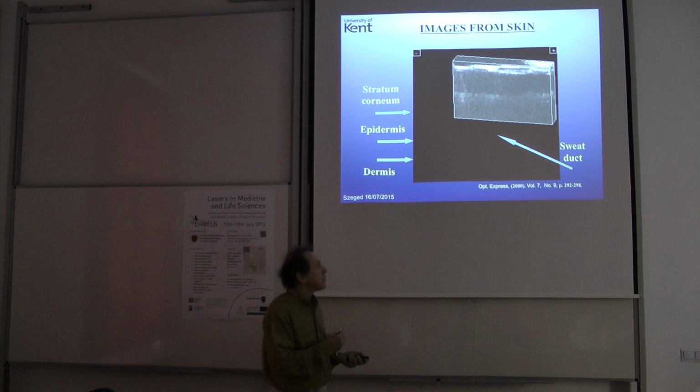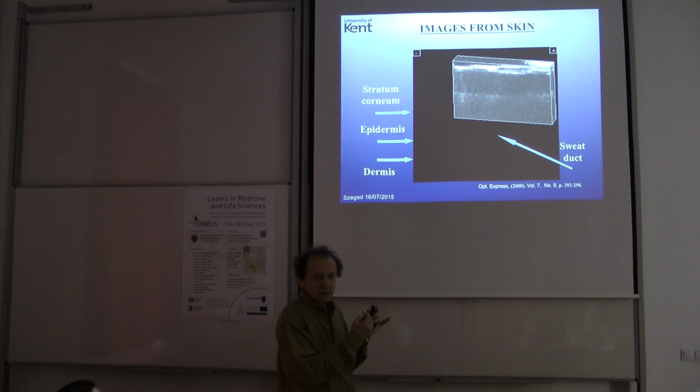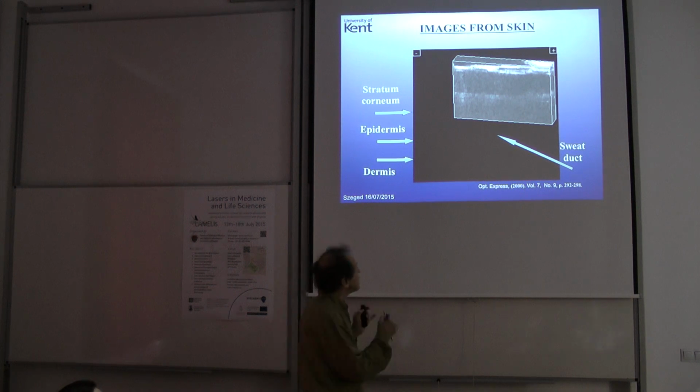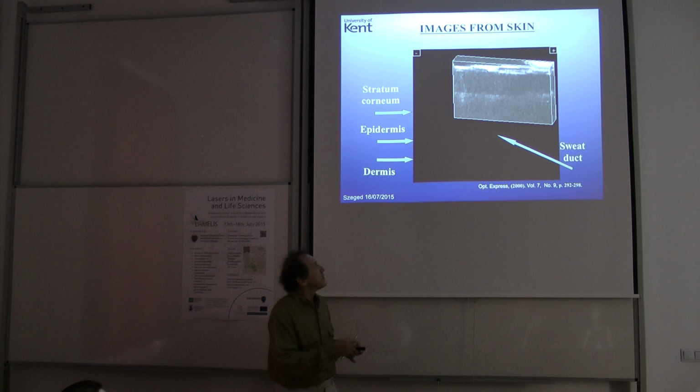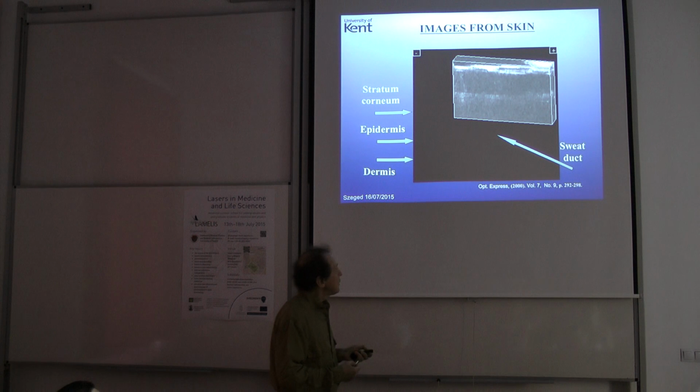Why do the users and the OCT researchers prefer to work with a tunable laser instead of doing it in time domain with a broadband source and moving the reference mirror? Because if you look at these two examples, they are similar. So what is the catch? What is the demand? What exactly is the element determining the choice? In terms of the penetration, it is similar. In terms of the axial resolution, it is similar. If you play with the numbers. So what is the difference?